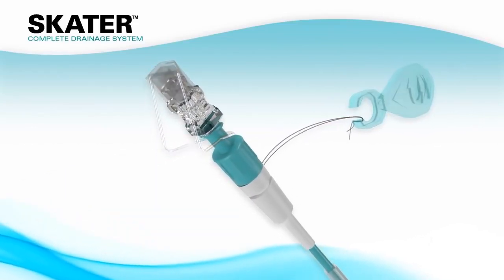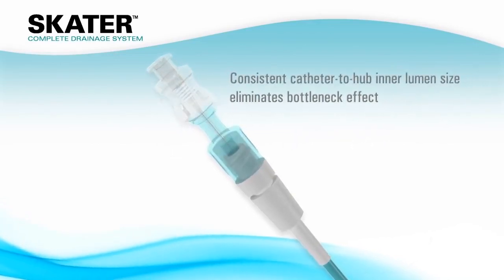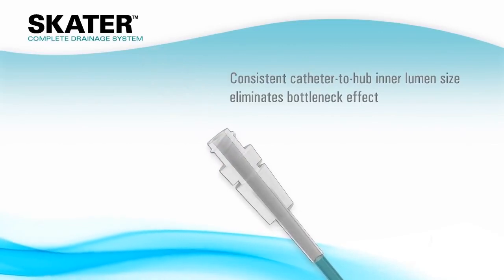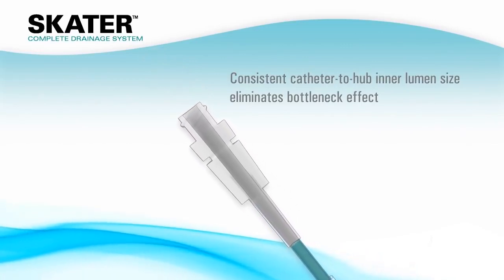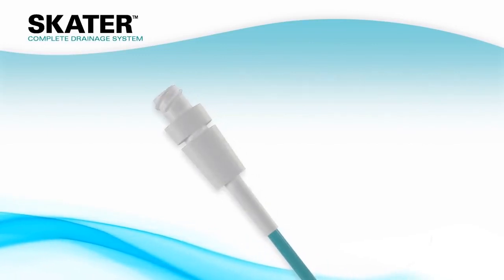The clinician and patient benefits continue at the catheter hub. The hub is sized to match the catheter to provide a consistent catheter body to hub inner lumen size, thereby eliminating a bottleneck effect.